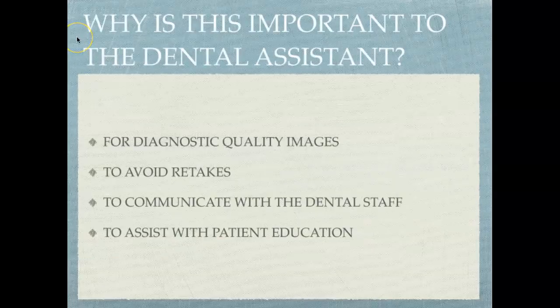You may be wondering why this is important to the dental assistant, because after all, in most states, dental assistants are not allowed to diagnose patient conditions, only the dentist and the hygienist in some states. But it is important for us to see our result on a radiographic image and to know that we have a diagnostic quality image or images. And I'm always pushing that point as a dental assistant that we have diagnostic quality images.